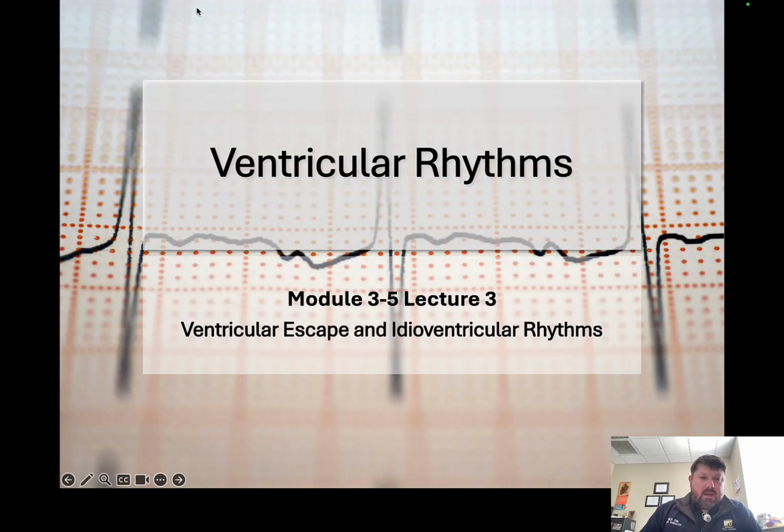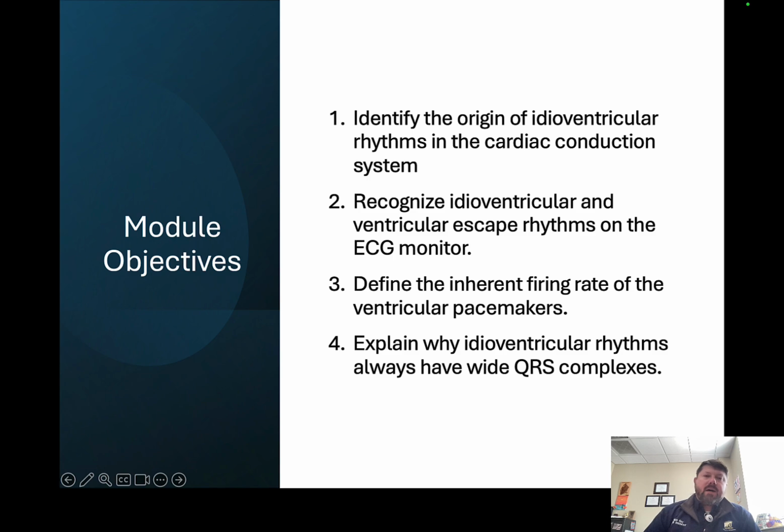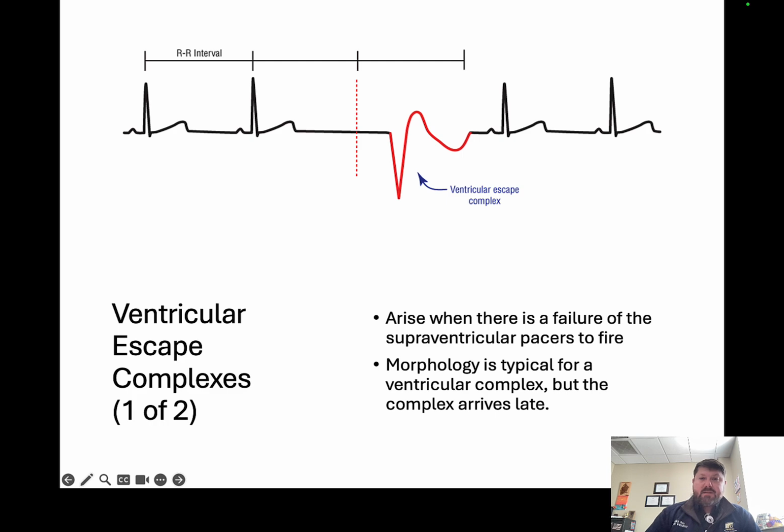Ventricular escape and idioventricular rhythms. We're going to identify the origin of idioventricular rhythms in the cardiac conduction system, recognize idioventricular and ventricular escape rhythms on the ECG monitor, define the inherent firing rate of the ventricular pacemakers, and explain why idioventricular rhythms always have wide QRS complexes.